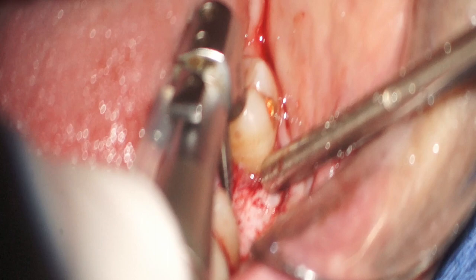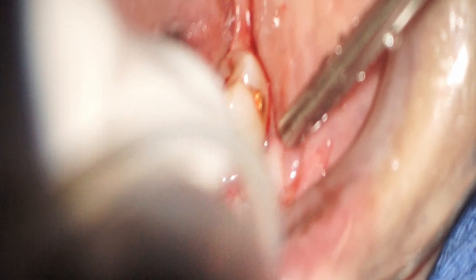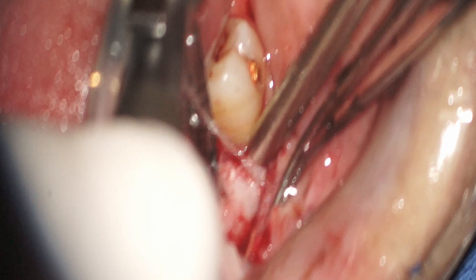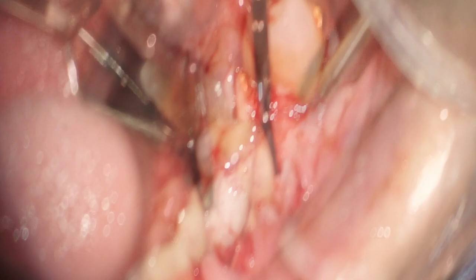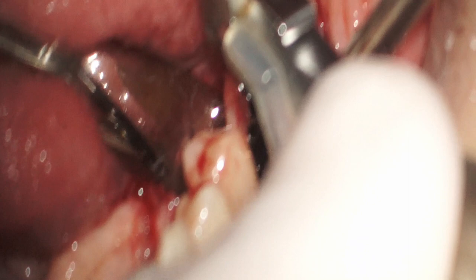Here we are preparing the site for the implant, and you can see the volume of new vital bone — there is visible bleeding in the bone and significant density. We mark the site with a round drill, then go to a 2mm twist drill, expanding sequentially to 2.2mm, 2.8mm, and 3.5mm twist drills, all in preparation to place a 4.1mm by 10mm fixture, drilling to about 10mm depth. What's impressive is that we don't clinically see a significant amount of bone particulate. As shown in histologic examples with GEM21S enhanced bone material, we get new bone over most of the graft particles and very fast bone turnover.